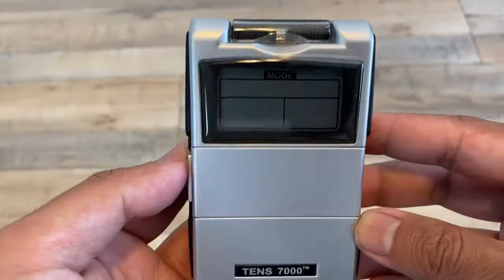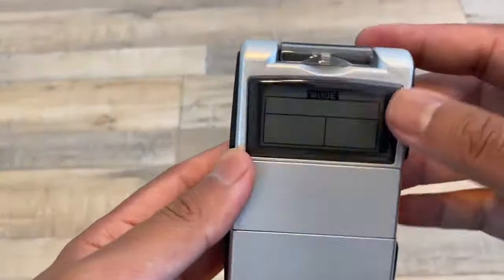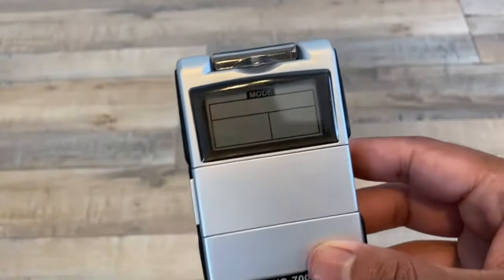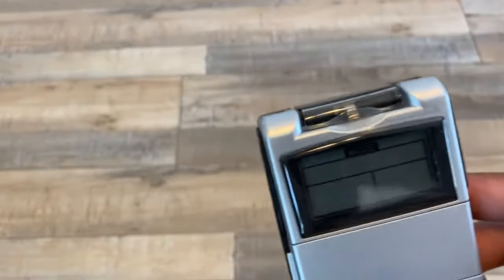But in this video, I'm just going to show you how to set this one up. Before you turn it on, you want to connect the electrodes.